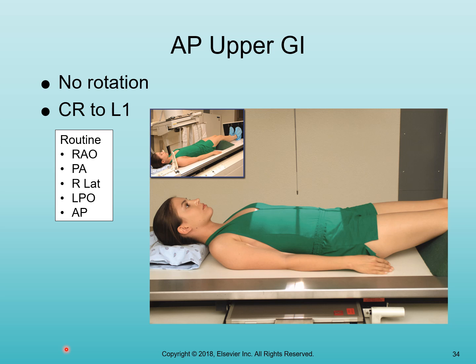So once the fluoroscopist leaves the room, I would ask the patient to go ahead and lie on their back. You would move the fluoro tower back. As you can see in this image, it's moved away from the patient. Nothing is here either. You would get out your image receptor and place that in your bucky. You would take the barium from the patient. You would kind of just clean up a little bit, but you're still going to have to take those images of your patient. So I would have the patient lie on their back.